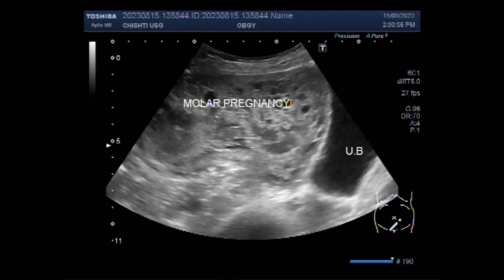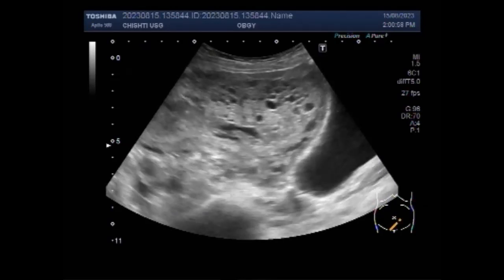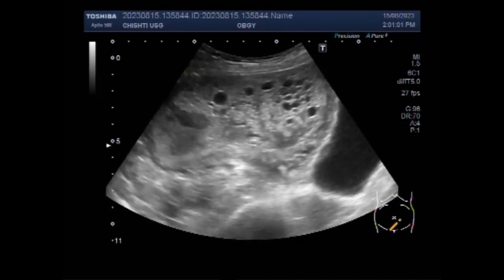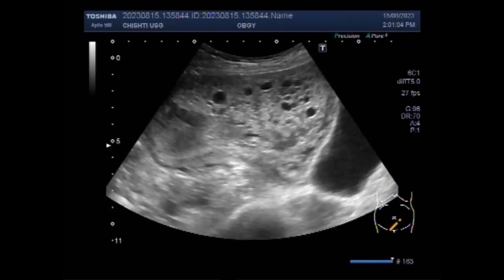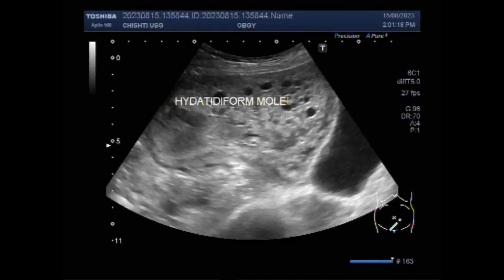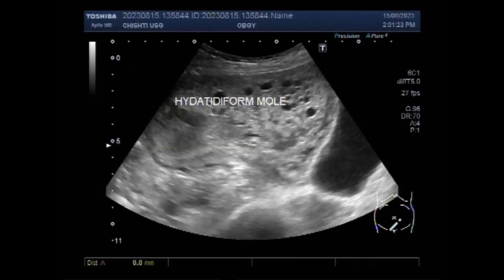Now you can see the molar pregnancy — the hydatidiform mole — and further in this video you will see both fetuses with fetal demise, demonstrating co-existence with the hydatidiform mole. In a complete mole, the ultrasound findings include a heterogeneous mass in the uterine cavity with multiple anechoic spaces.